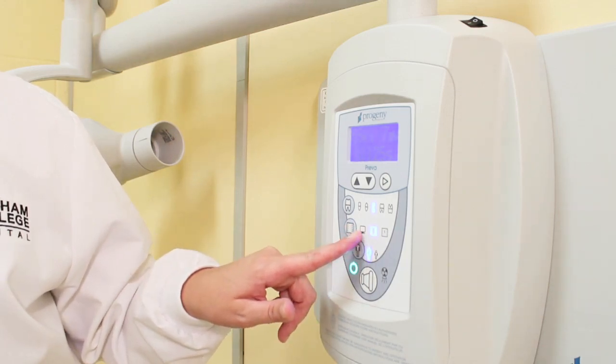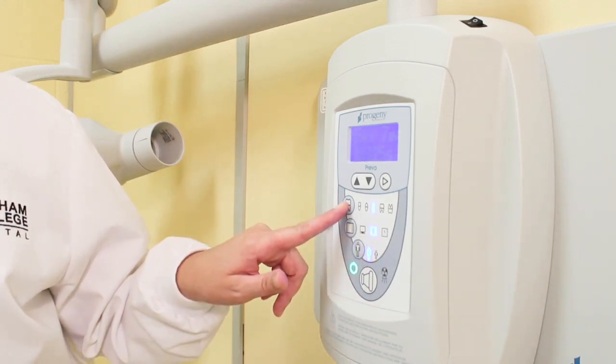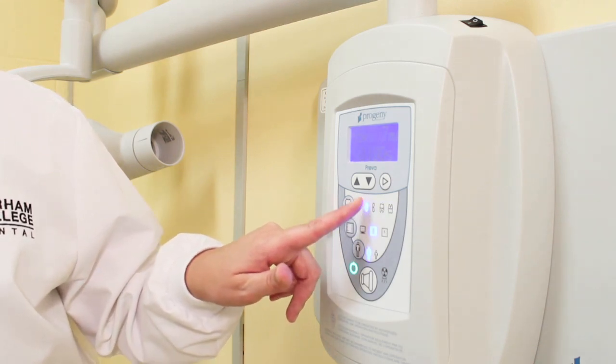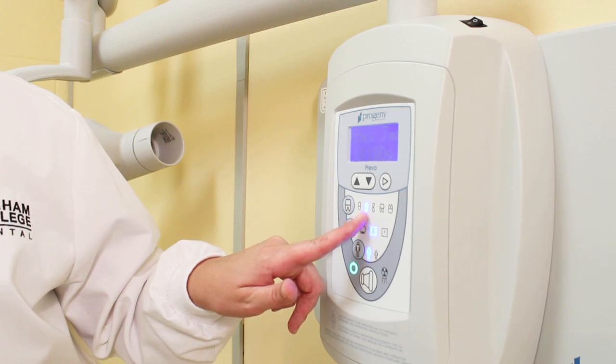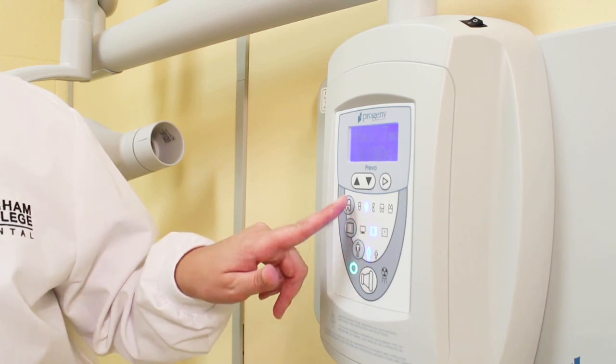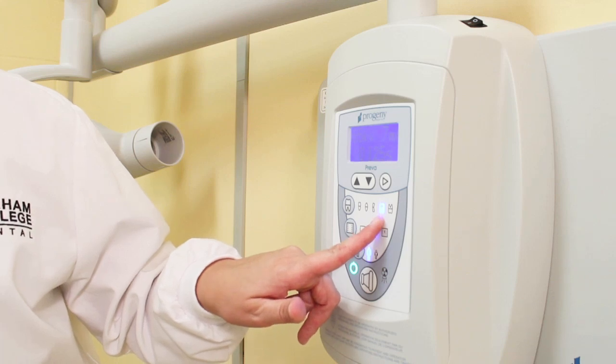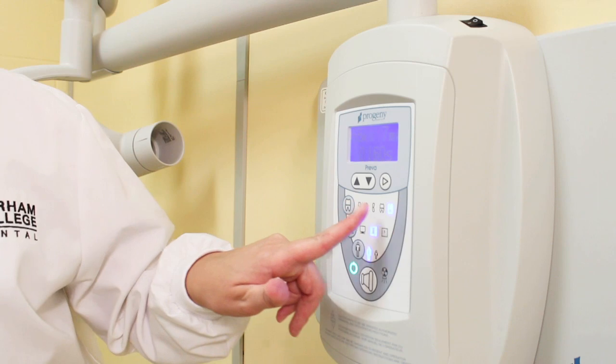And I'll change the tooth icons, the pictures on the control panel, when I'm taking the premolar views. I have the same icon for both the maxilla and the mandible. For the molar views, I have an icon for the mandibular molar and a separate icon for the maxillary molar.